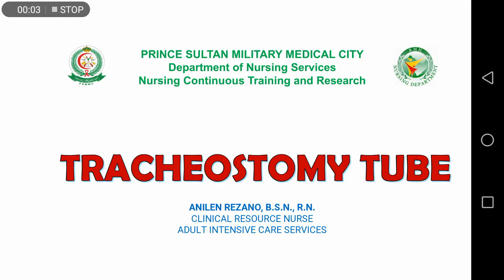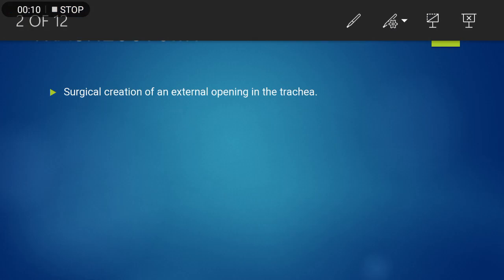Hi, today we are about to discuss the tracheostomy tube. So what is tracheostomy? Tracheostomy is a surgical creation of an external opening in the trachea.